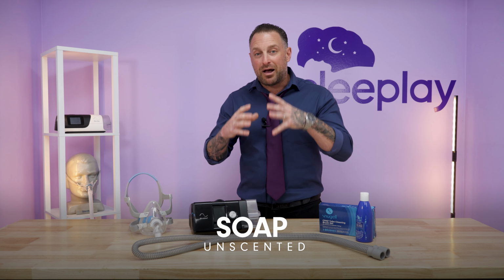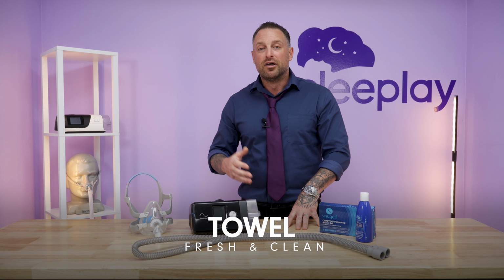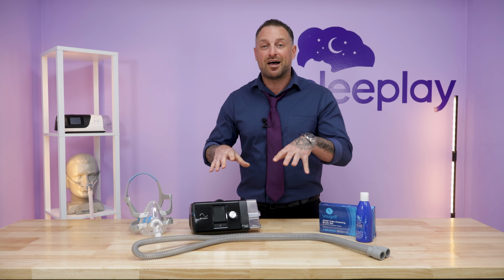The third thing would be the soap or the detergent you're going to use. You want to get mild detergent, nothing too harsh. They do recommend vinegar and water as well, but you're going to go ahead and mix that in with the water, and that's how you're going to clean all these products. The fourth thing is a clean towel, so you can dry off a couple of things afterwards and set down your products on top of it.